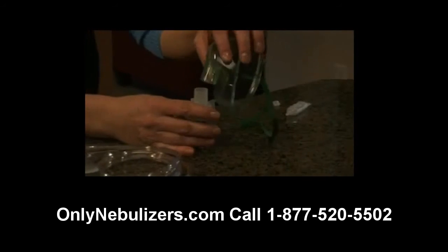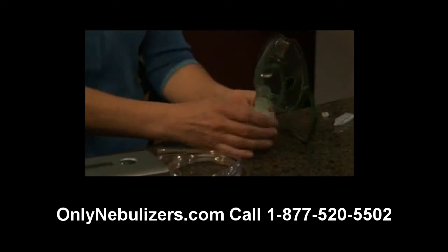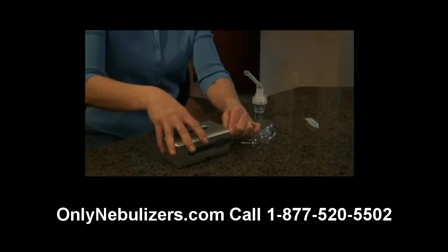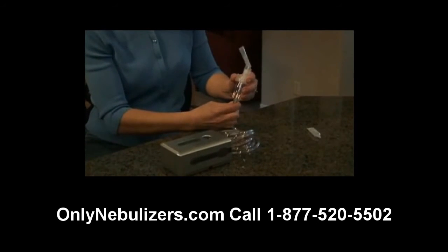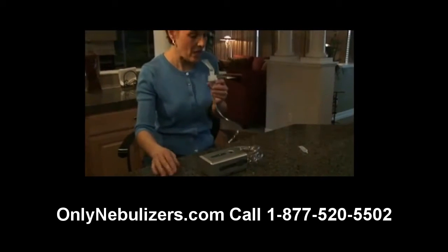If you're using an aerosol mask, place the mask adapter directly into the top of the nebulizer cap. Finally, attach the tubing to the nebulizer air inlet connector.